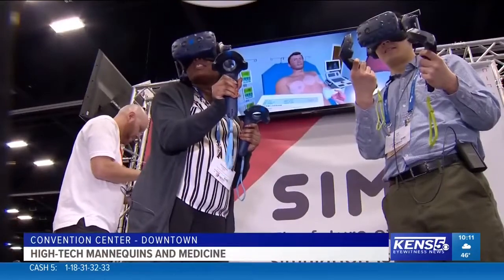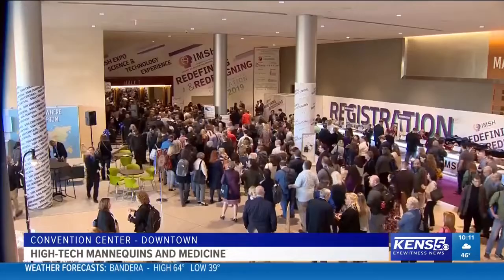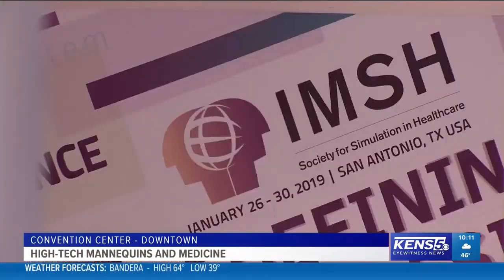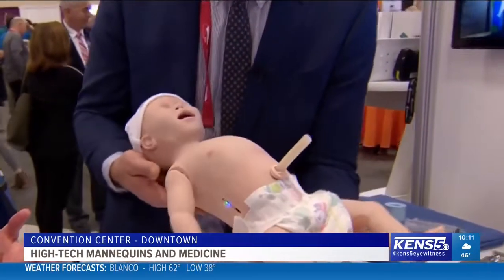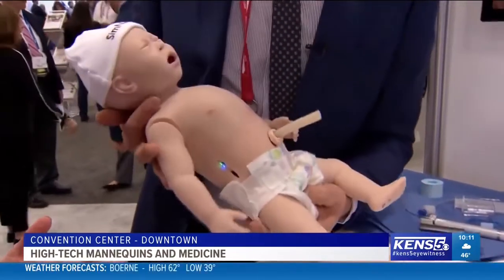Hi, sir. What brought you to the hospital? This is the International Meeting for Simulation in Healthcare. It's the largest meeting of simulationists and healthcare professionals in the world. Just one of the simple things we need to do is handling a newborn baby and to just actually handle it. So this is made to size and weight to scale of what a newborn baby is.